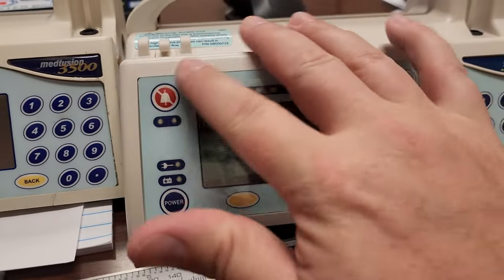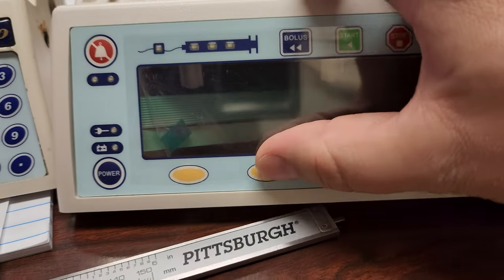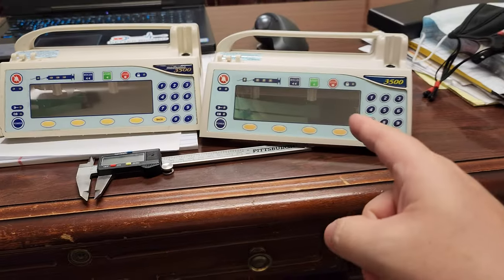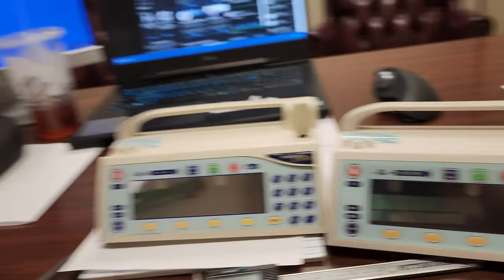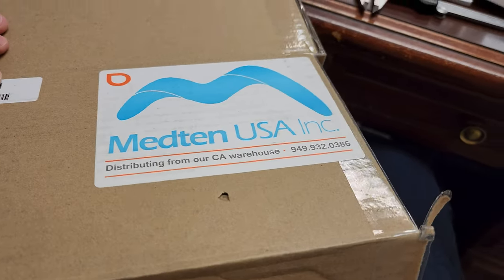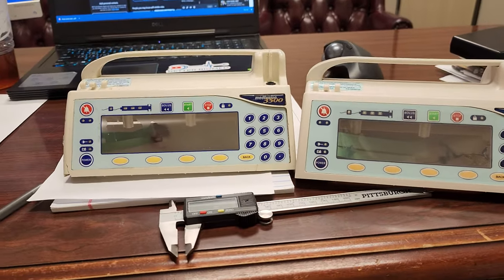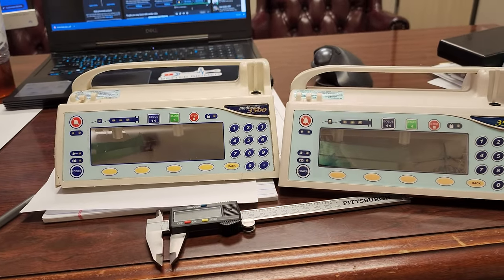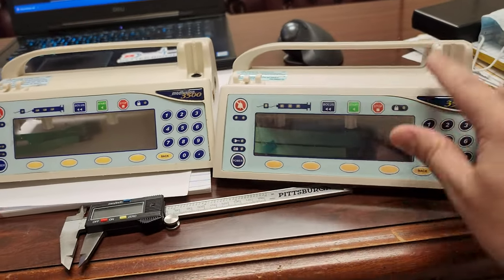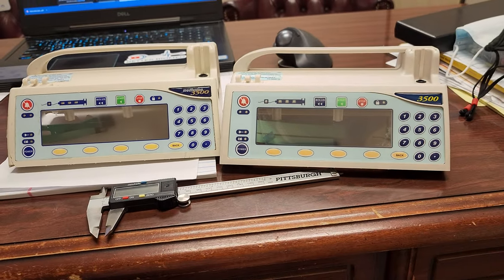The control panel on this aftermarket part feels fantastic — each of these buttons is real solid. I know iMed sells these, and of course the guys over at Med10 USA sell them too. It's an excellent product. I've checked everything with the caliper just to make sure there's continuity between the two parts. It should fit completely and you would never even notice if it wasn't for a few of the identifiers being different. It looks like an OEM part.